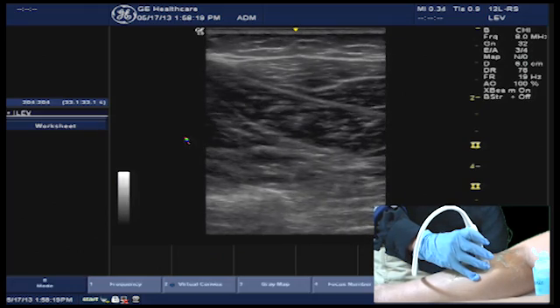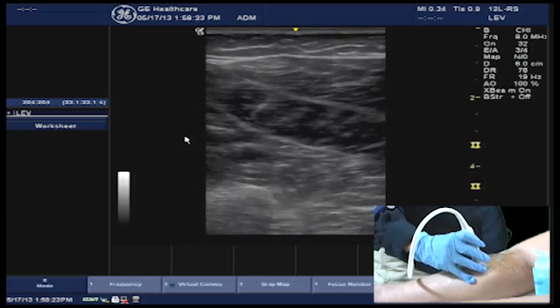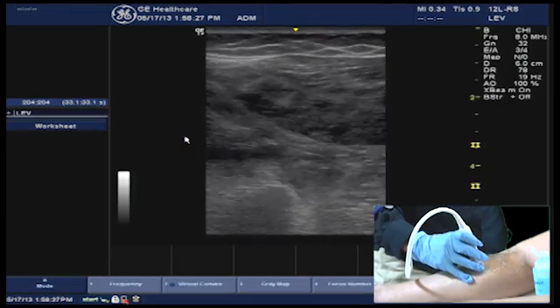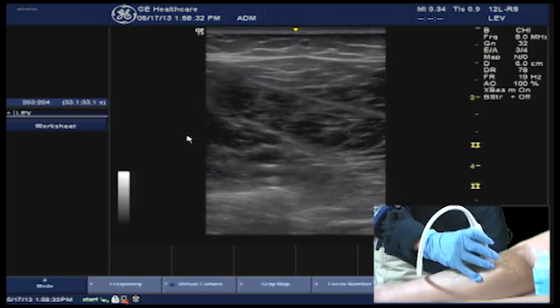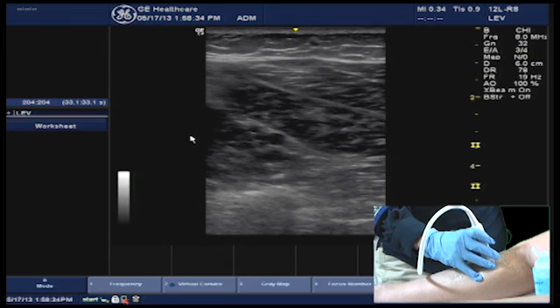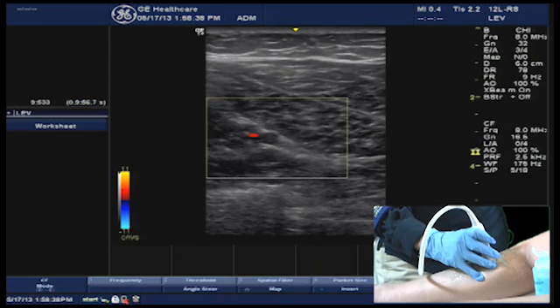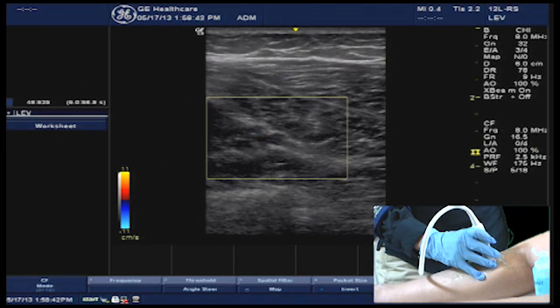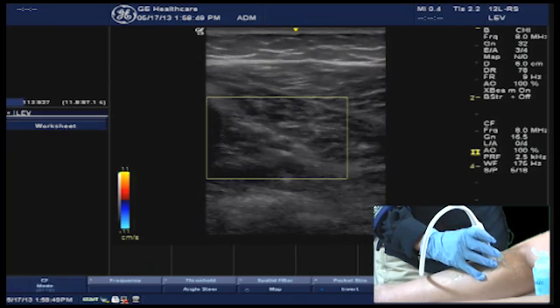By making intermittent compressions down the leg, you're able to easily follow the posterior tibial and the peroneal vessels in one scan plane. If you still struggle with trying to identify the vessels, you can also turn on color and identify the posterior tibial and the peroneal arteries. As we see here, the posterior tibial artery and the two anechoic posterior tibial veins adjacent to it — you can then compress down and evaluate the vessels.